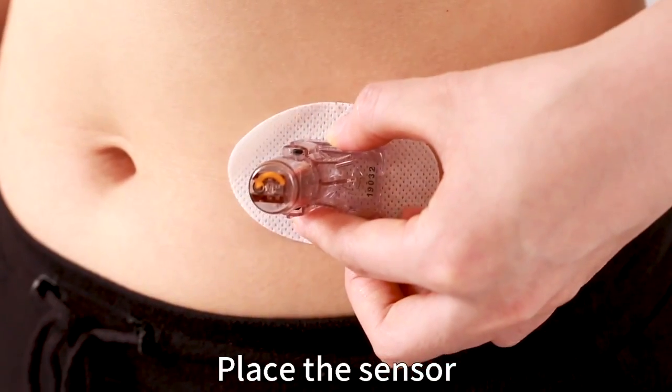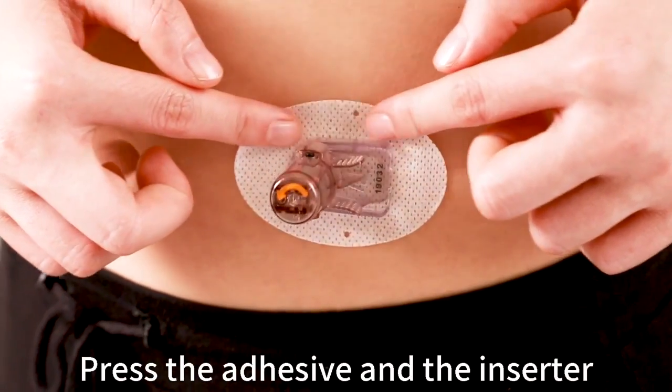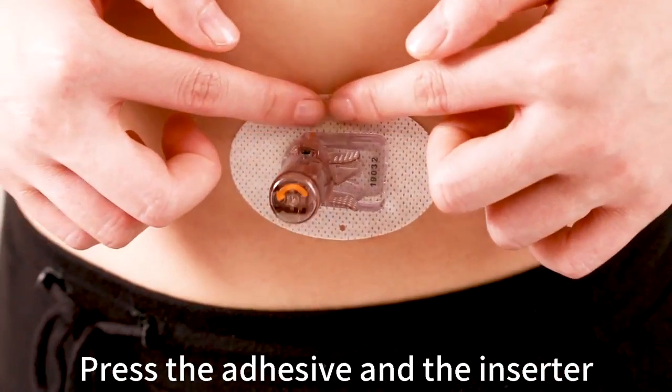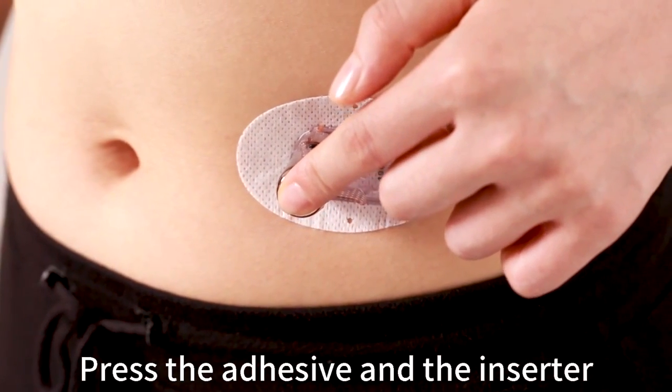Place the sensor horizontally on your abdomen. Move your fingers around the adhesive patch, then press the insert cylinder to secure the sensor to your skin.